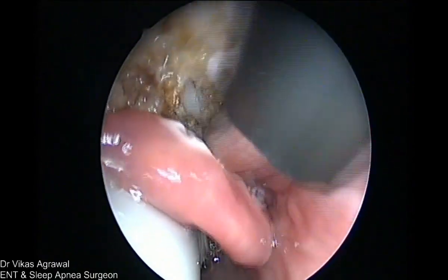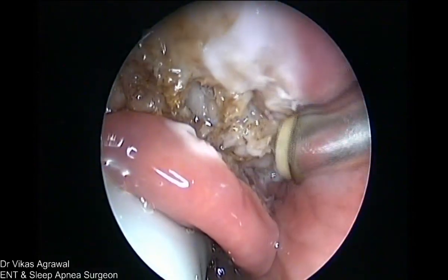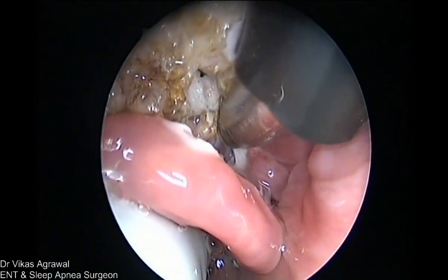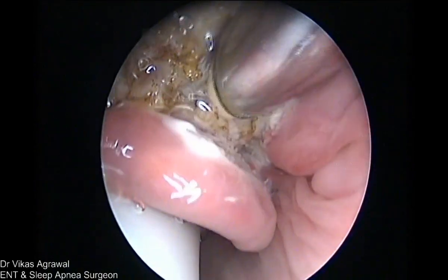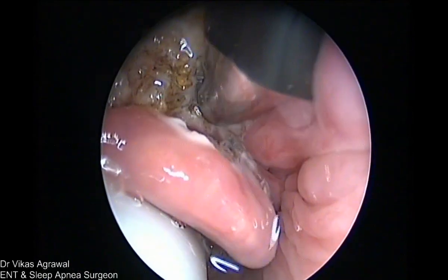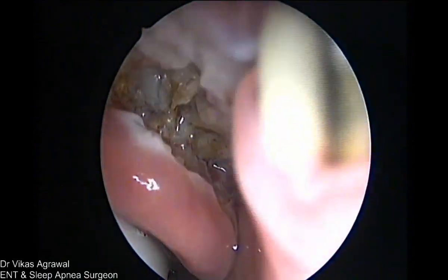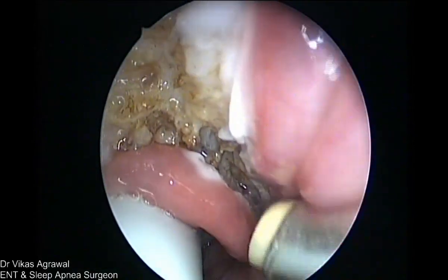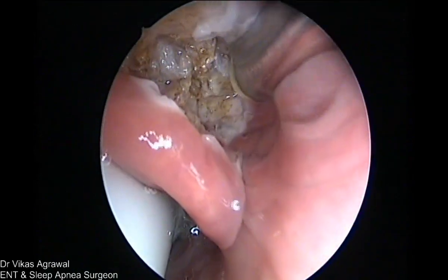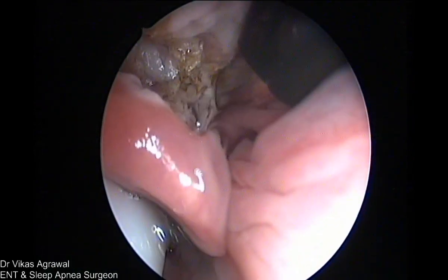So I'm removing all this, but laterally, if you go very deep laterally, you can hit small vessels, not the lingual artery, but small vessels, which can bleed. Okay. So right now, see, this is the midline. This is lateral, right? So when you go lateral, you do not try to ablate too much. You try to coagulate more. Okay.